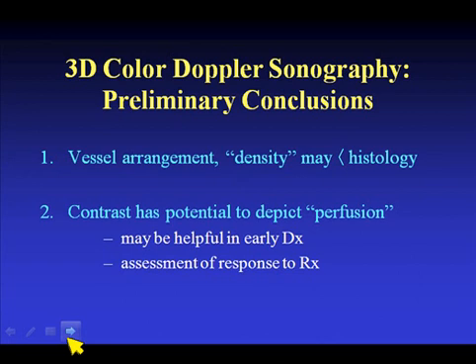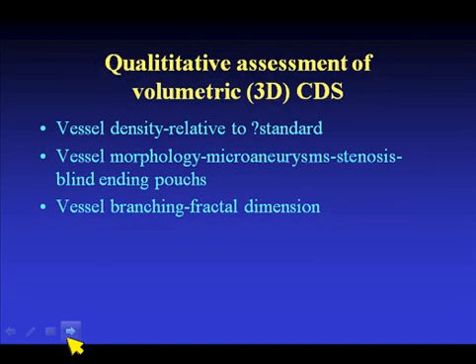3D allows us to see the vessel arrangement. The density may correlate to histology. And finally, I want to show you some examples of contrast to depict perfusion.